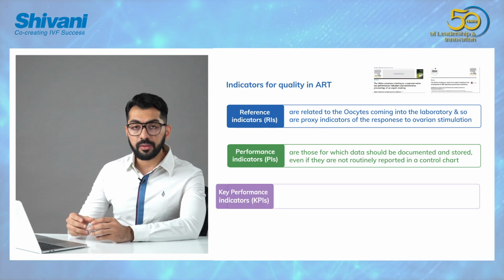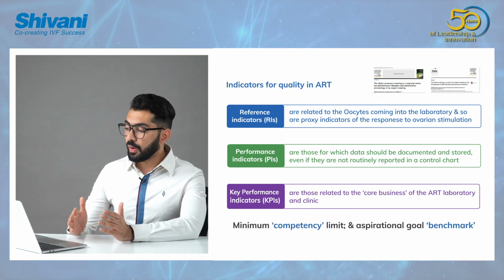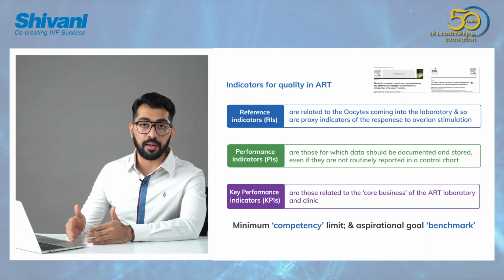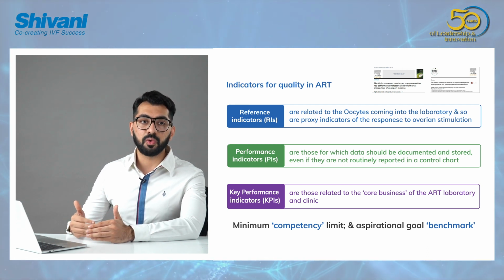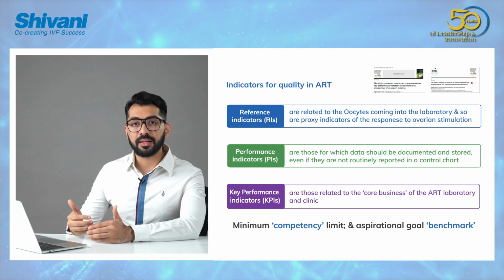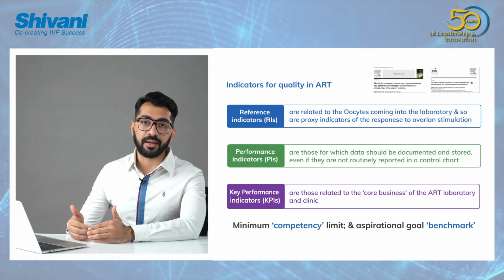And key performance indicators are the core business of an ART laboratory. Without these key performance indicators, which are 12 in number, any laboratory would not be able to monitor the quality of its performance.